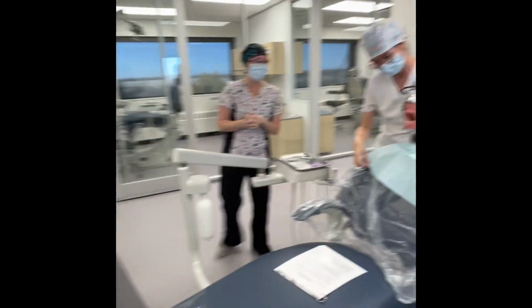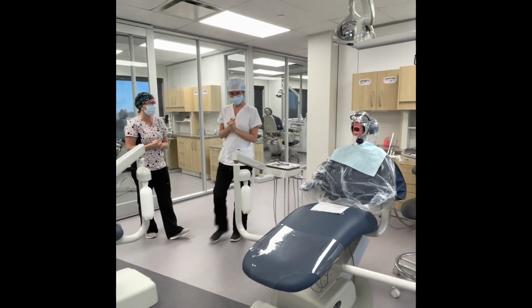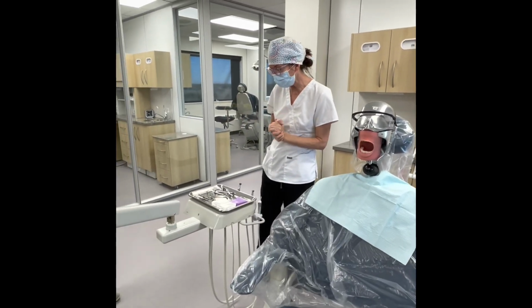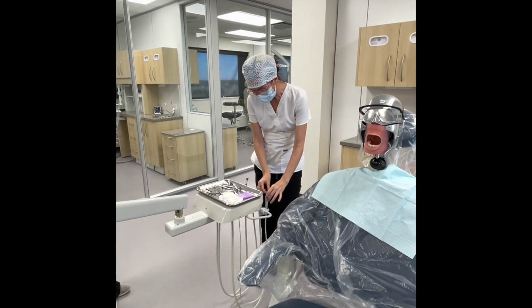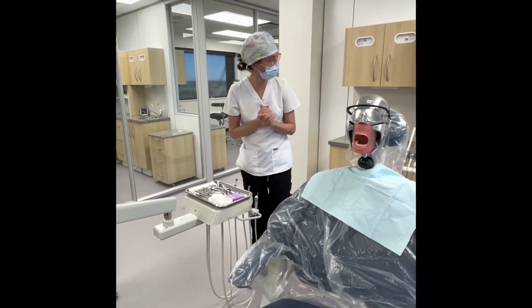So Martha has been seated in our chair for us. What Stacy's going to do first is confirm her setup here, okay? Yeah, so I've done my setup. We have pictures of this that will be at every operatory. I've set up my dental dam. I have some burrs out. I have set up my hand pieces. I've checked my water and my syringe tips for 5 seconds, like you've all been taught to do.